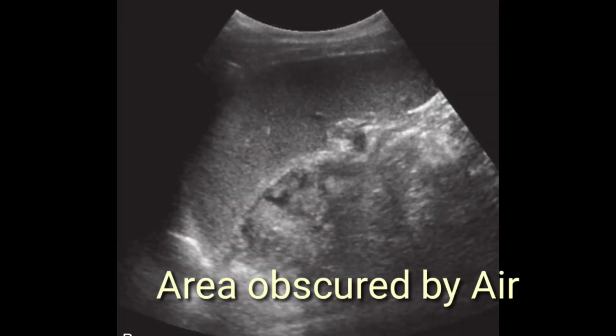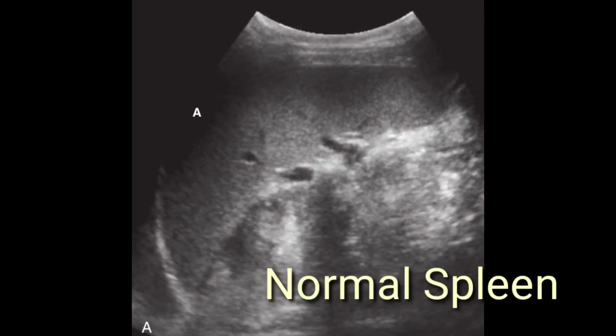This is a normal spleen image on ultrasound. Here in this image, the posterior superior aspect of the spleen is obscured by the air within the lungs. Aerated lungs obscure the spleen. The best way to view the complete image of the spleen is to put the patient in the decubitus position and ask them to take a deep breath in. When the patient inspires, the spleen will slip into view and you can take the image to analyze it. Here in this image you can appreciate the normal spleen.